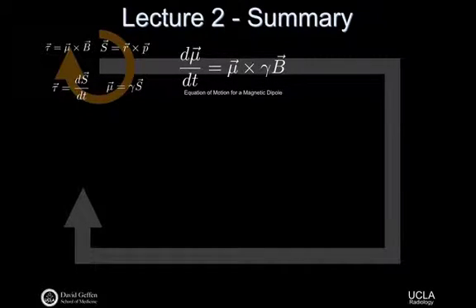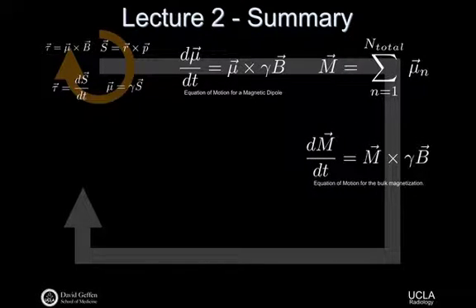So then this is maybe the summary of where we were, right? We had several equations that described the torque of the magnetic moment in the B field, the definition of torque itself, angular momentum, and then this empirical relationship that tied together the spin angular momentum and the magnetic dipole through the gyromagnetic ratio. And we worked through some steps where we could get this equation of motion, and at the beginning it was just the equation of motion for a single spin, which doesn't really make a lot of sense. A physicist would really be offended by that. But that's okay, because we said, well, we'll step away from that and we'll just add everything up. We have 1 million, 1 billion, 1 trillion more of these spins. We'll add them all up and we'll give ourselves a new equation of motion for the bulk magnetization. And we're going to see this expression show up again today.